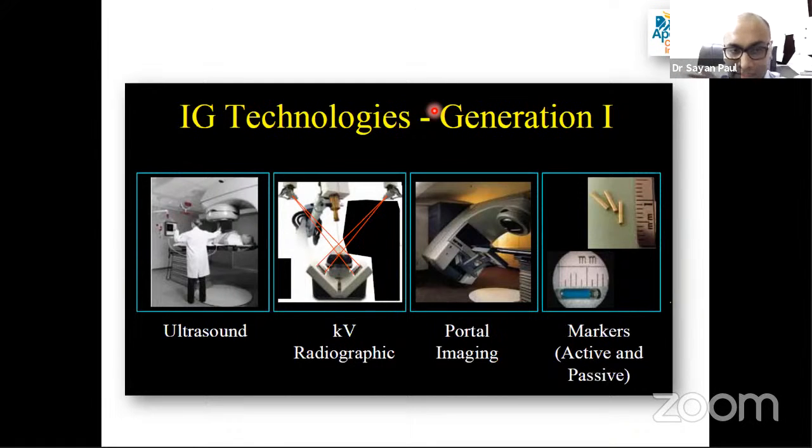To see the target during treatment delivery, many types of technologies were developed, like ultrasound, KV radiograph, portal imaging, internal fiducial markers, taking images and matching the markers.